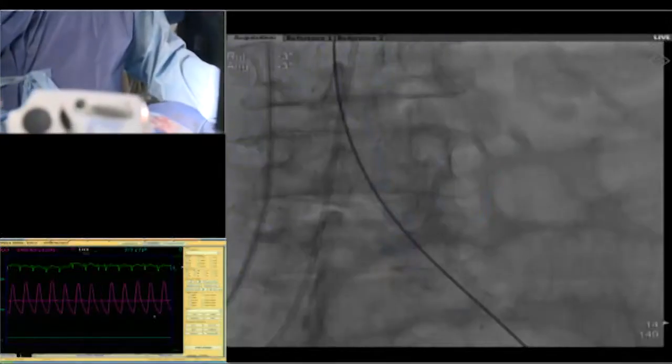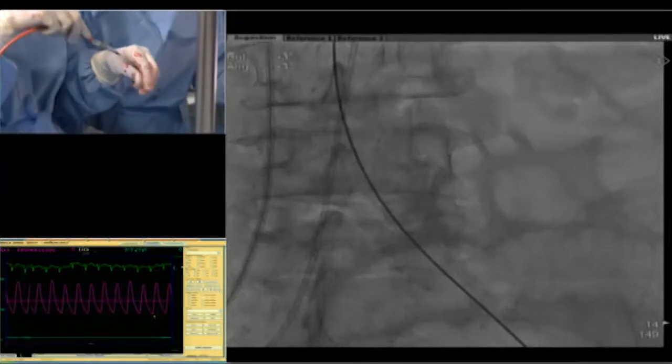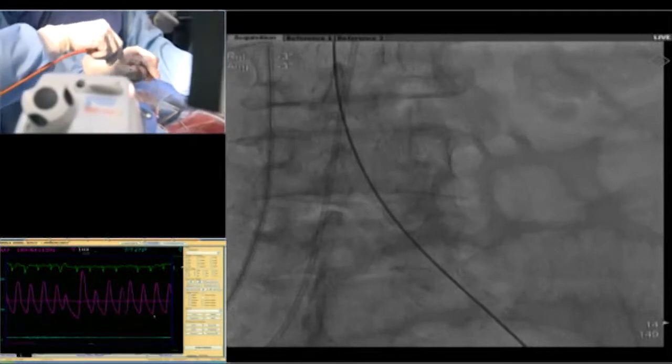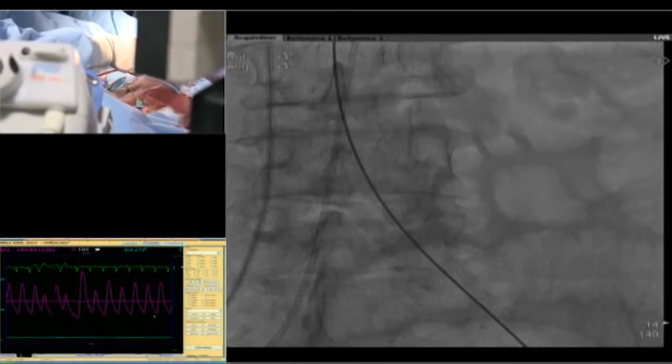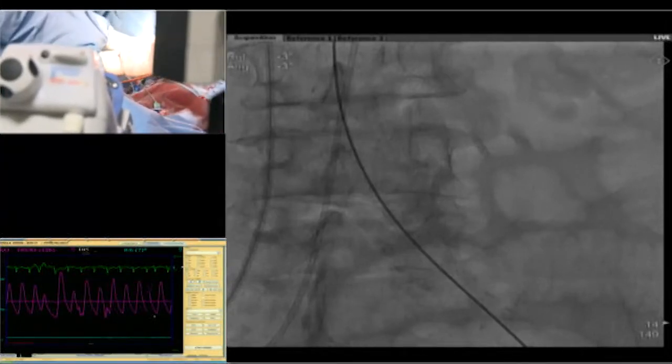Okay. Who's on the injector? Is the injector ready? We'll be connecting. Wait, we have time. We'll connect. Let's go in first. Okay, so now we have to pull. Okay, that's fine. So what do you have to do? I don't have the wire yet. Let us see. Okay. You got the wire?